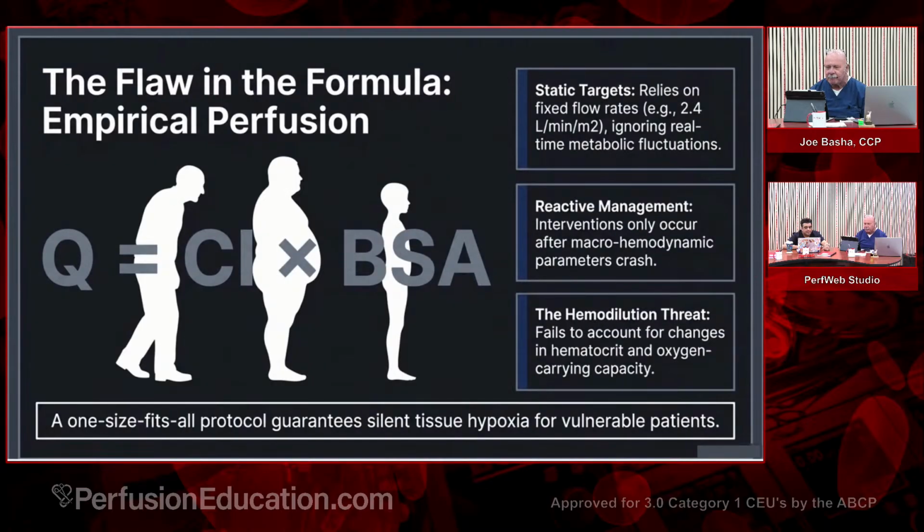That's my opinion. And then the flaws in the formulas. Well, you see the dude on the left, that's me. I'm probably not going to need quite as high a flow as the person on the far right, a younger person, healthy, higher metabolism, more musculature versus fat.